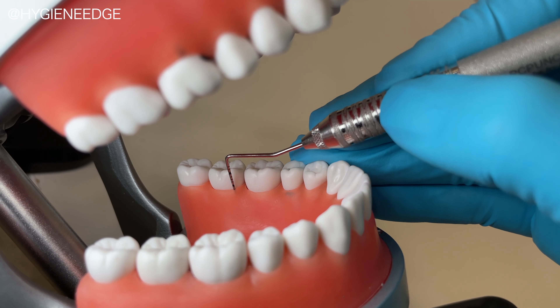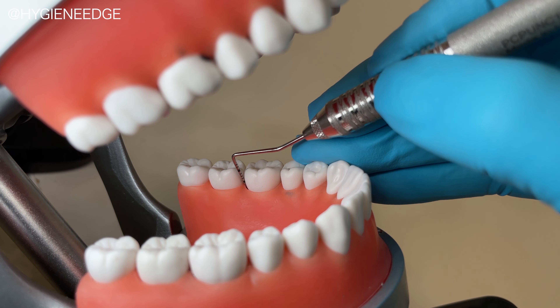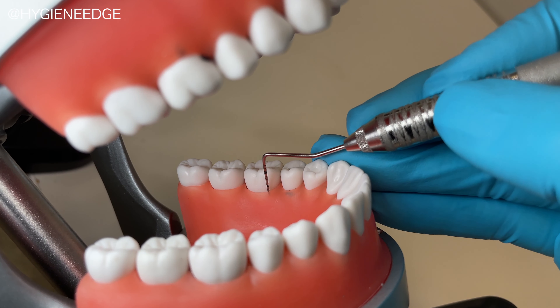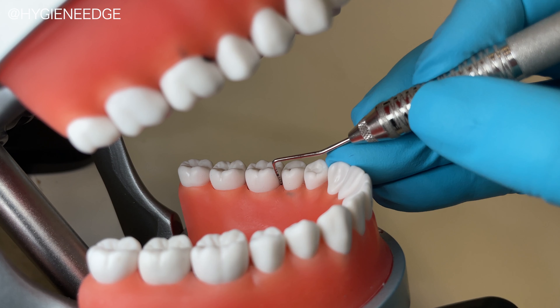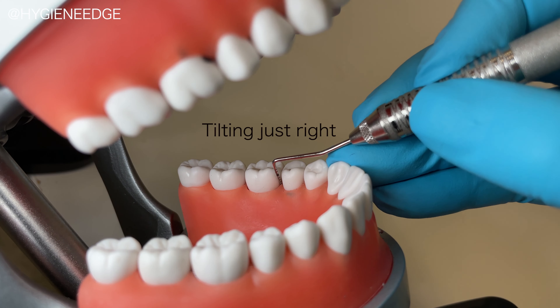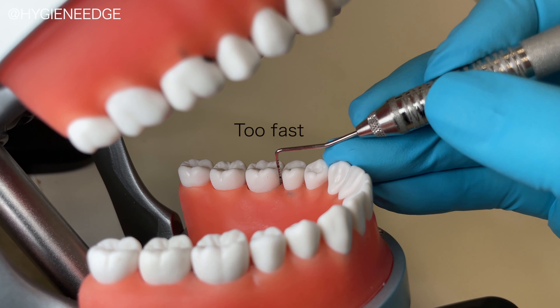Let's first take a look at probing. If the clinician isn't calibrated on how to achieve accurate probe depths, you can easily evaluate where the error is while working on this typodont. Due to a better model with improved gingiva and bone levels, a clinician can get the proper feel of how far to walk the probe, how much to tip the probe under the col.